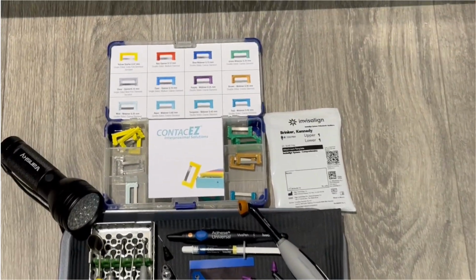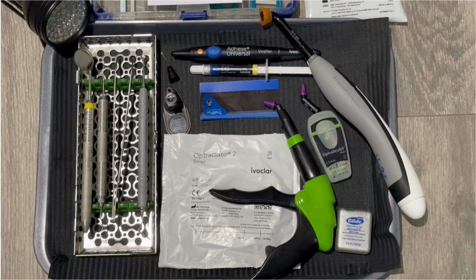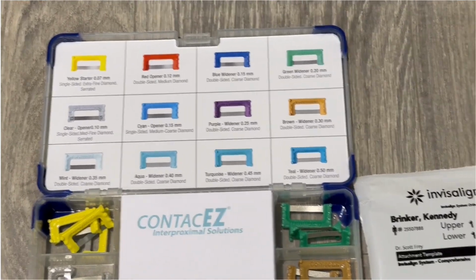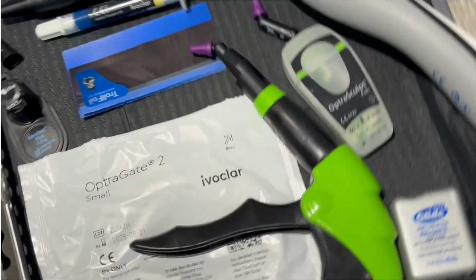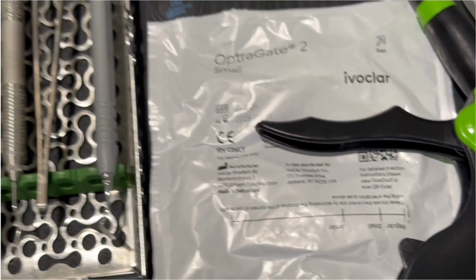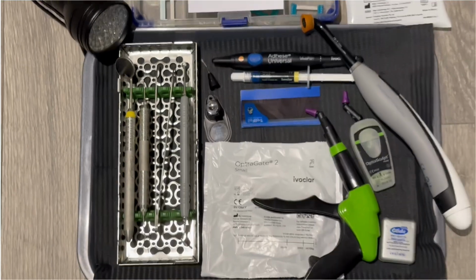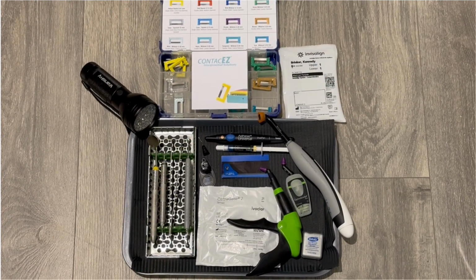Here we have lots of products that are within your hands-on kit, and we actually dive deeper into this when we get to our hands-on. But basically, what I like to do with all of my assistants is set up my room completely, and I will take photographs of my setup. So these are the products that we'll utilize in the hands-on, and most importantly, for every attachment delivery. Having our isolation, make sure we're utilizing the right instruments. You'll hear me talk a lot about the OptraSculpt instrument, or what we used to call the OptraPad.